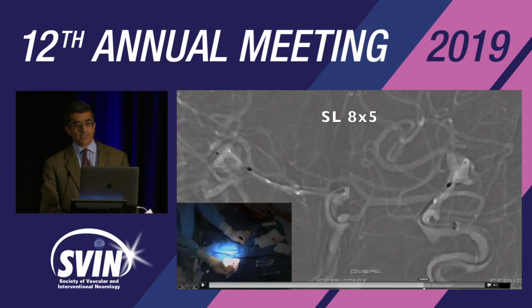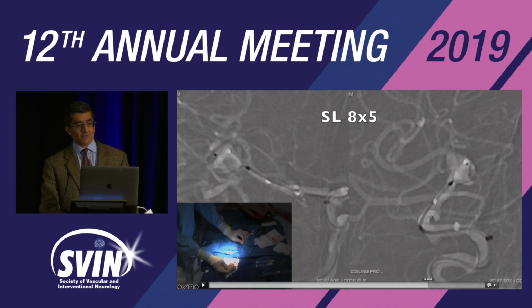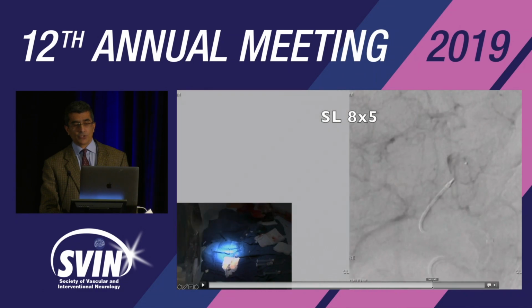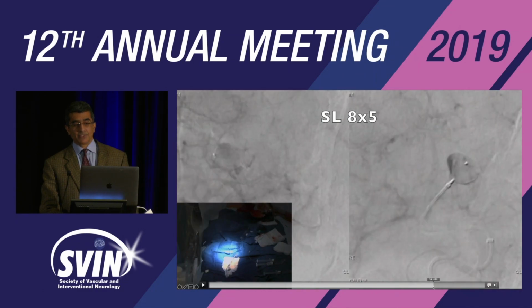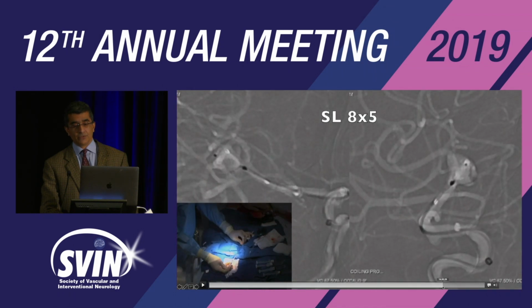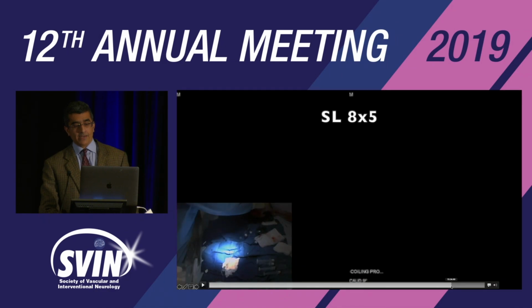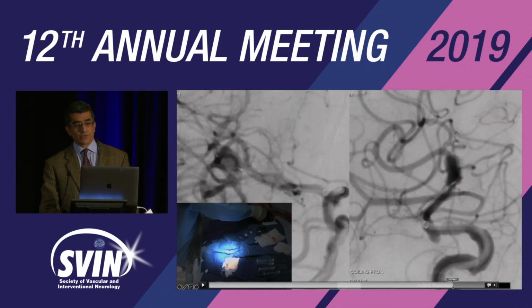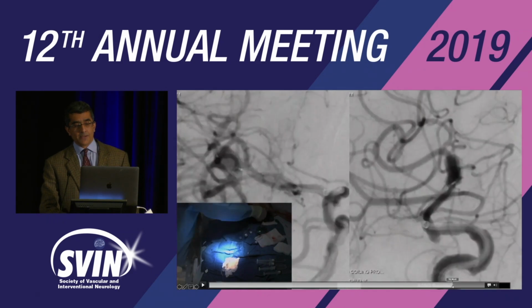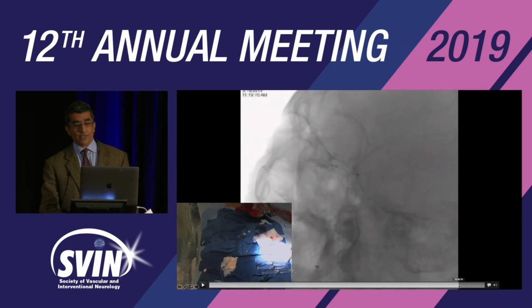And 50 seconds, so we'll run through it. This case took about 15 minutes from puncture to closure. Normally, a 9 millimeter MCA bifurcation with a wide neck incorporating an M2 will take at least 10 to 12 coils, about an hour. And as Lucas already showed, the device, once deployed up to about 60%, is pretty safe to manipulate.